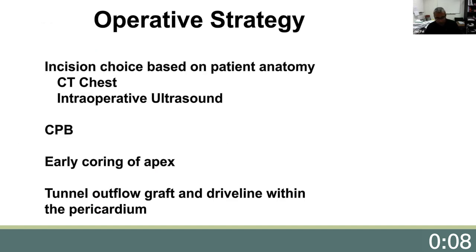The general strategy I use for thoracotomy implants is shown here. I found that most patients can be implanted via this technique. If a patient needs an aortic valve procedure, this can be performed through these incisions as well. Some surgeons will also address the tricuspid valve through an upper hemisternotomy, but I find that it requires such an extended incision that it obviates some of the benefits of the thoracotomy approach.